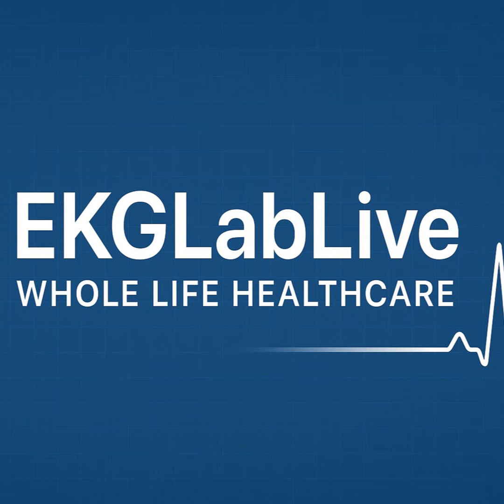Right. Your inferior leads, so leads 2, 3, and AVF, they're all sitting down at the bottom of the heart. Since the retrograde electrical wave is moving directly away from them, the pen drops below the baseline. So you get an inverted negative P wave. Yes. And conversely, lead AVR is sitting way up on the right shoulder. The retrograde wave is rushing right at it, so lead AVR will show a completely upright P wave. Okay, so the morphology, the shape and direction of the wave, tells us the signal is moving backward.